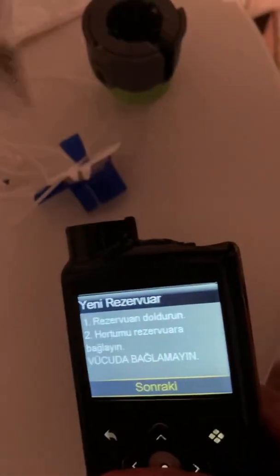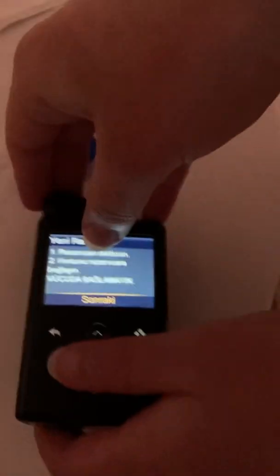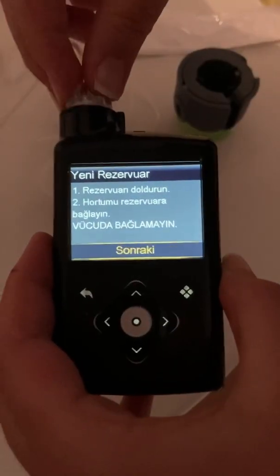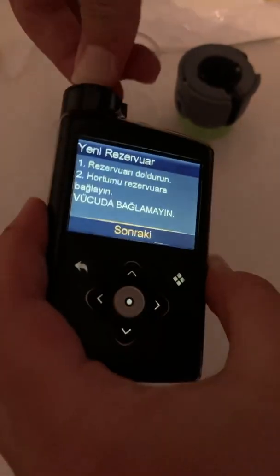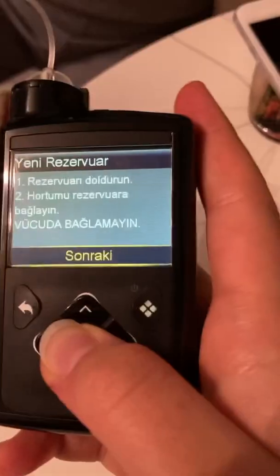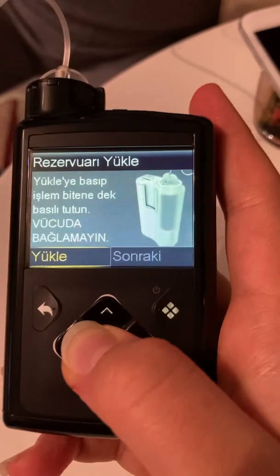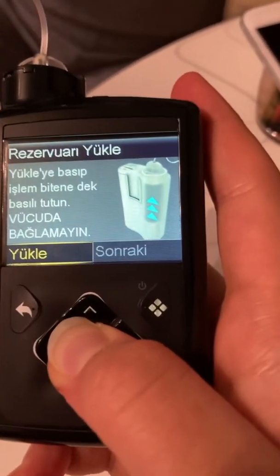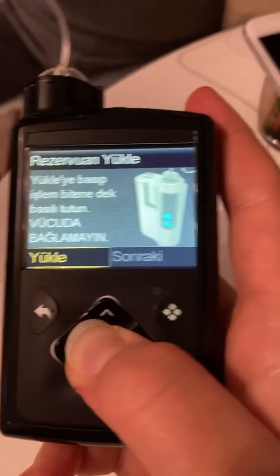Now we're removing the old injector and putting the new injector into the pump. You have to turn it a couple of times until you sense the click sound. Then I do the in-and-out move to make sure it's not falling out. After doing all these steps, press hard and long on the middle button again.